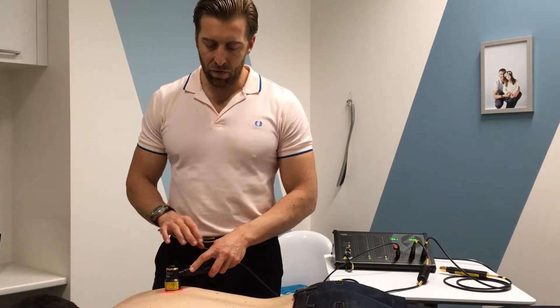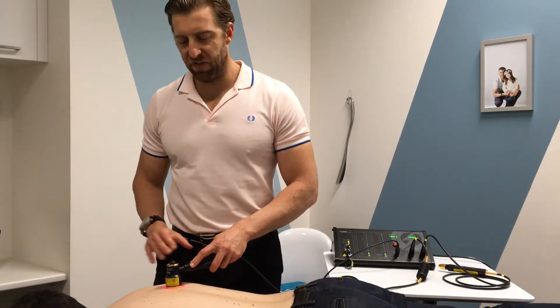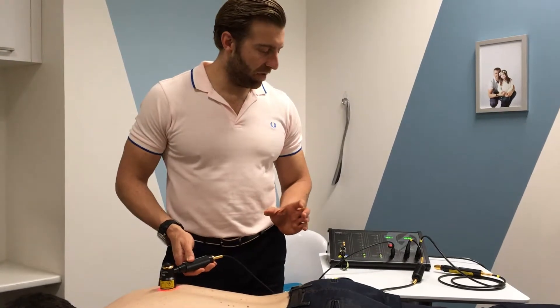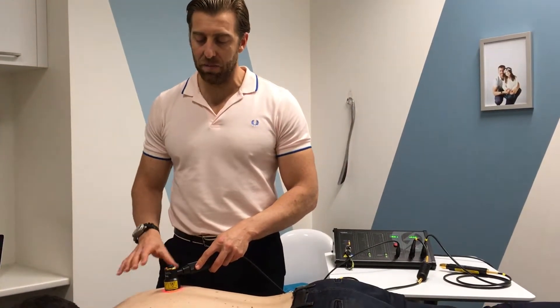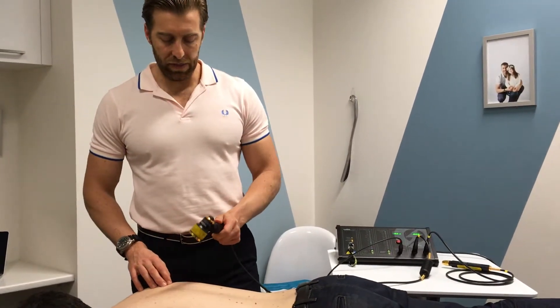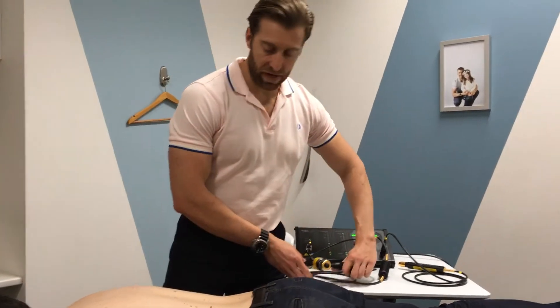I would choose the area to treat on Lou and do five to six minutes using this diode. I also have a slightly bigger one for covering a larger area, but this particular probe is a little more penetrating than the bigger one, and I want to get to the deeper parts of the tissues.